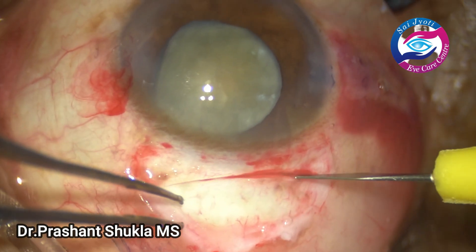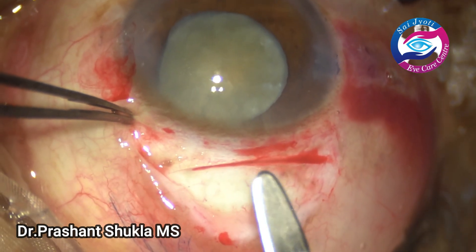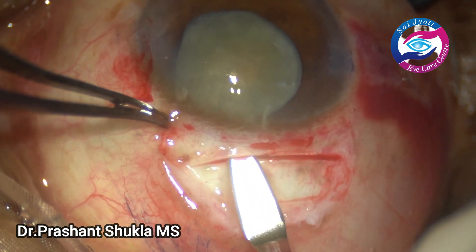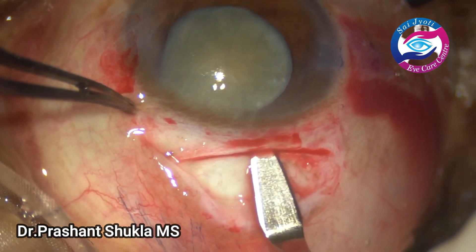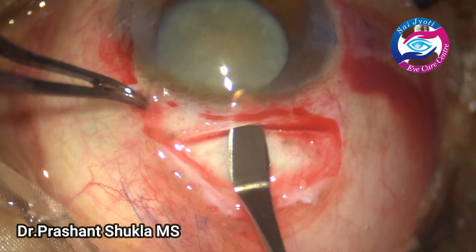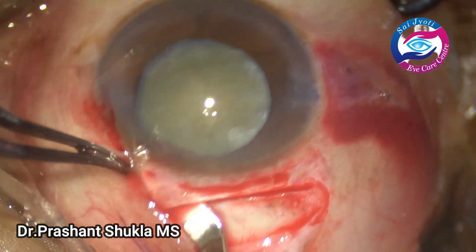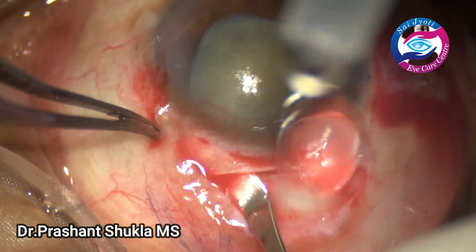Next, a 6.5mm partial thickness scleral frown incision is made and the ends of the incision are marked. A crescent is then gradually moved in a wriggling motion entering the cornea about 1 to 1.5mm so that we have a very secure and tight wound. It is then extended on the left side into the cornea and scleral pockets are made.